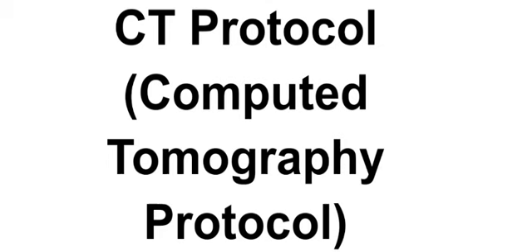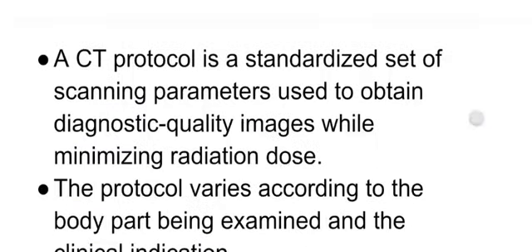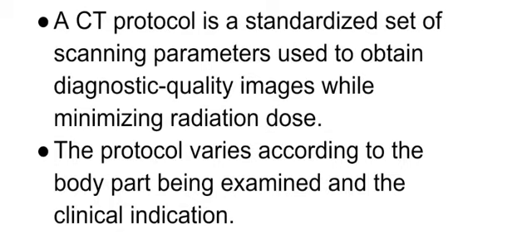Today we are going to discuss the topic CT protocol, that is Computed Tomography Protocol. First, what is CT? CT is an imaging technique in which we use a complex structure with a multiple detector system, which can detect changes or any abnormalities found on the body of a patient. And in CT there are several protocols which have to be followed for specific organs or a specific part of the body.